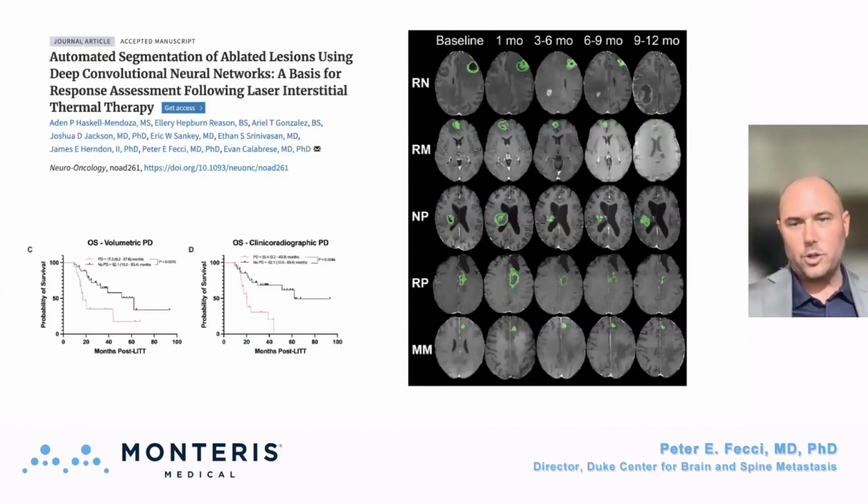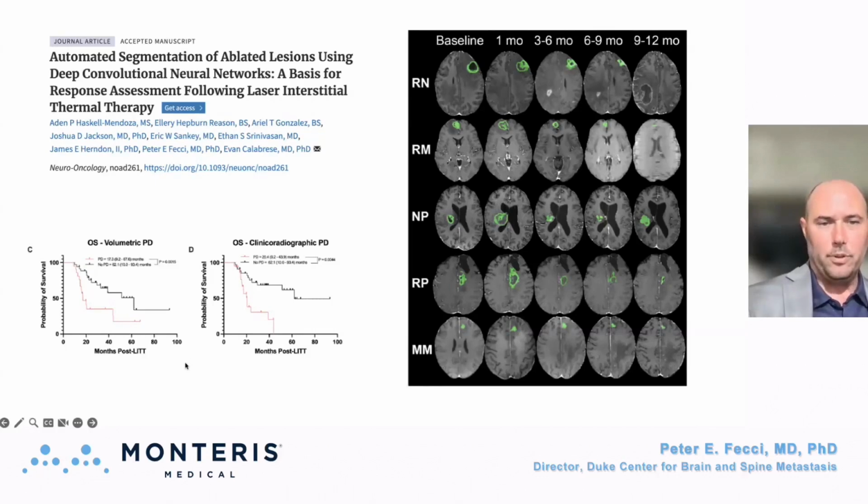Our radiologists here have now started to develop AI regimens to kind of quantify this and have used it to try to divide patients up by essentially that volume to deconvolute them into essentially responders and non-responders. And if we use that algorithm and separate people out into who we think are responders or not, and then look at how people did based on survival, you can see that we actually get a real parsing out of the survival and response to treatment. And so this does seem to be a fairly reliable means of parsing your response out. And just of note, this is a paper that just recently came out in the last few months, actually, and is now out in Neuro-Oncology.